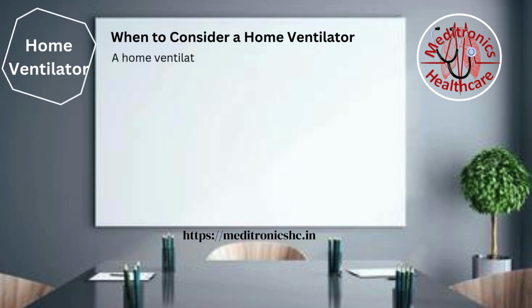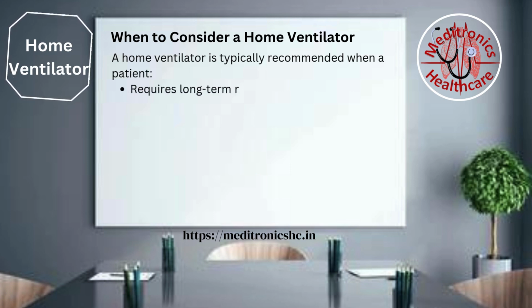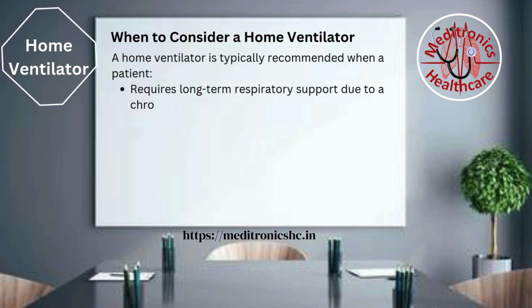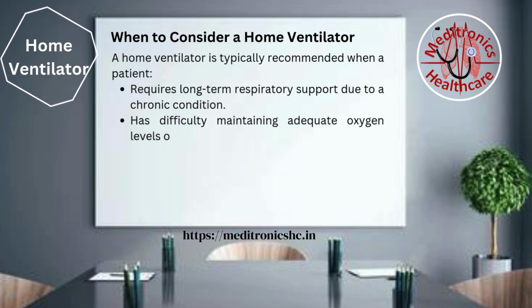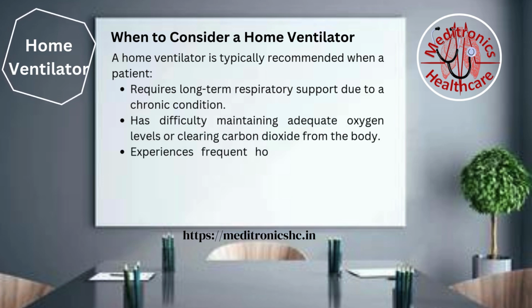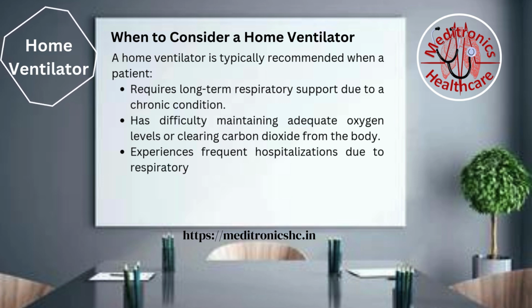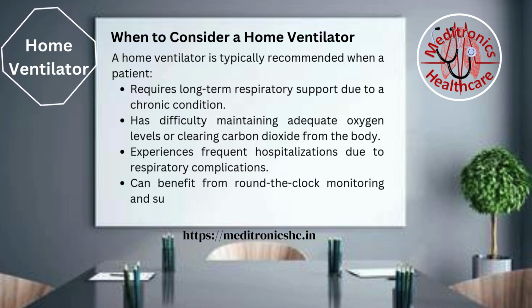When to consider a home ventilator. A home ventilator is typically recommended when a patient requires long-term respiratory support due to a chronic condition, has difficulty maintaining adequate oxygen levels or clearing carbon dioxide from the body, experiences frequent hospitalizations due to respiratory complications, or can benefit from round-the-clock monitoring and support at home.